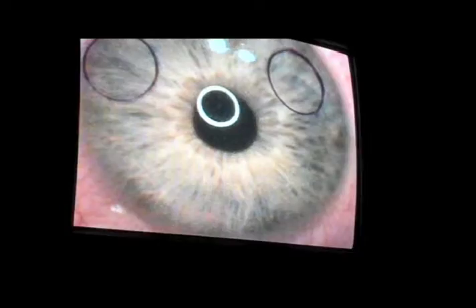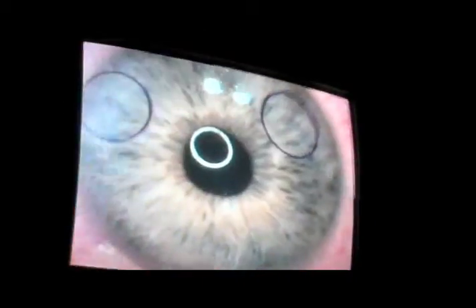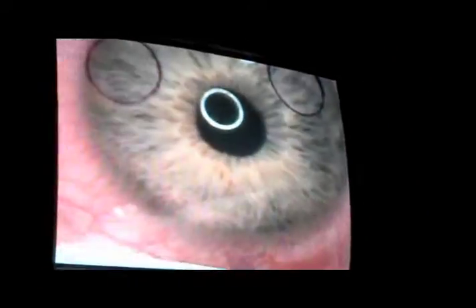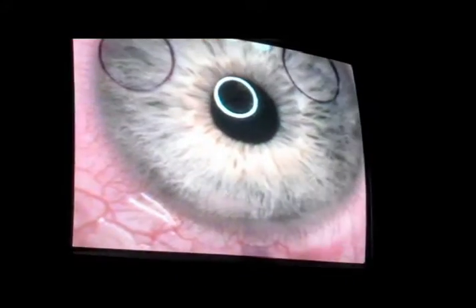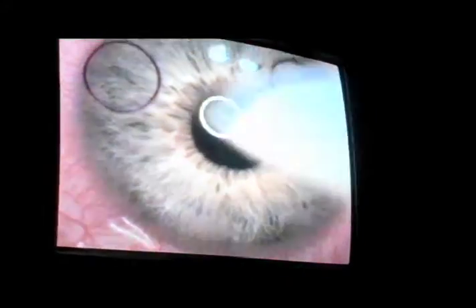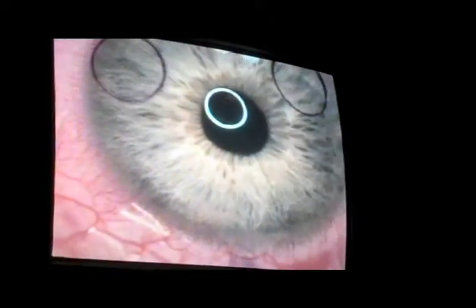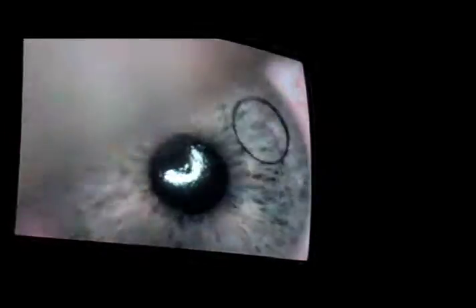And we've got to wait about another minute for everything to settle down so the flap can be back in place, and just so you can check things out and make sure everything looks pretty good. At this point, Dr. Hale notices that there's a little bit of bruising up at the top part of my eye, underneath my eyelid, so you can't see it just looking at it. But that was caused back at the first laser with that little suction. That's normal, and it should go away in the next day or so, he says. He takes the clamps that are holding my eyelids out, and it's time to move over to the other eye.